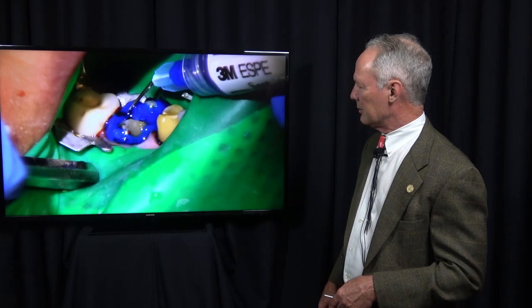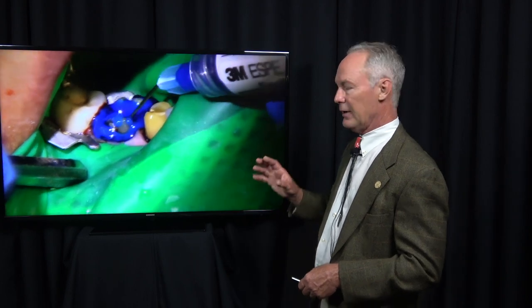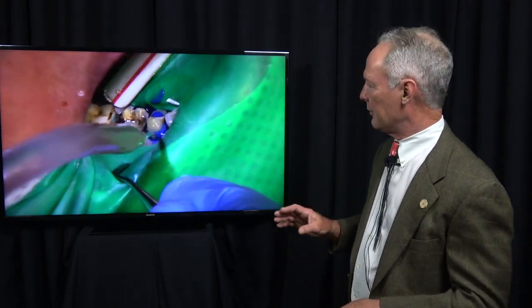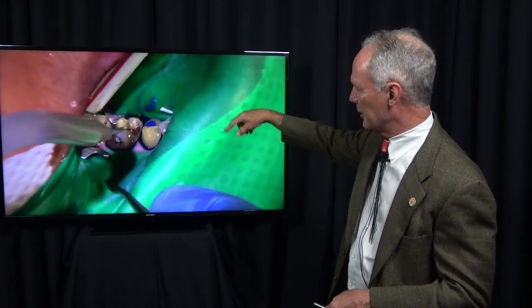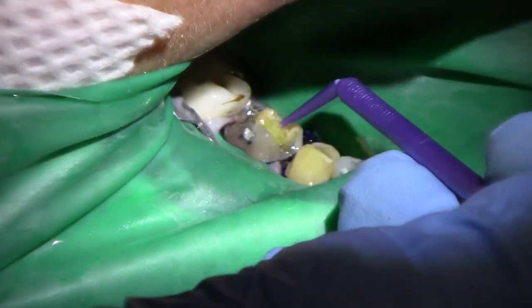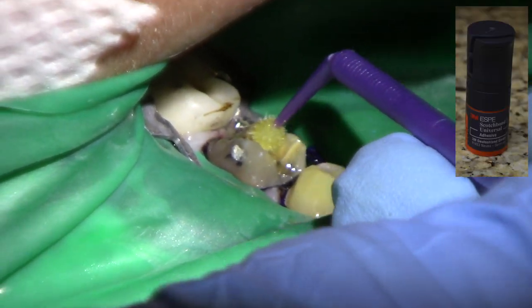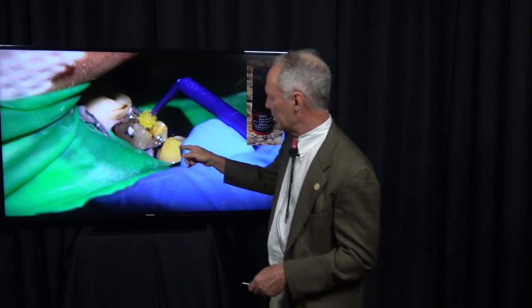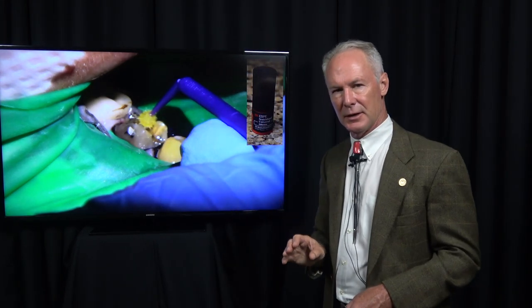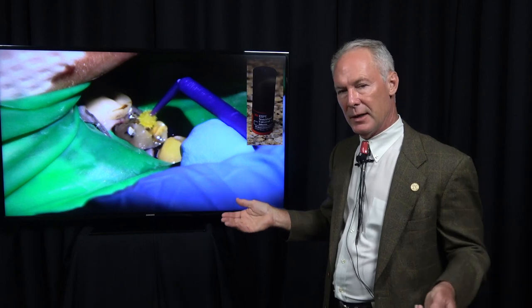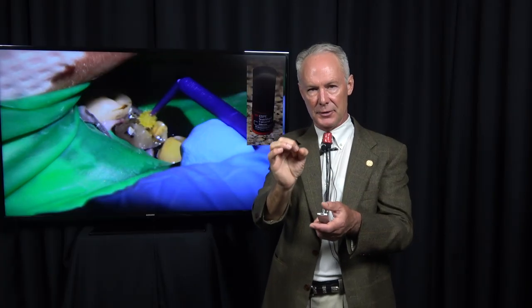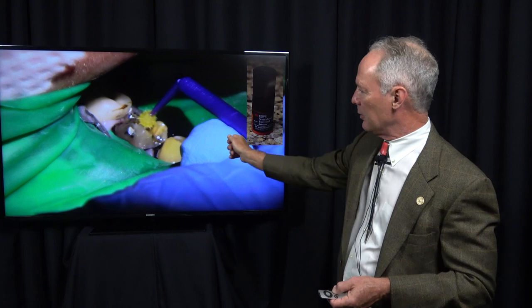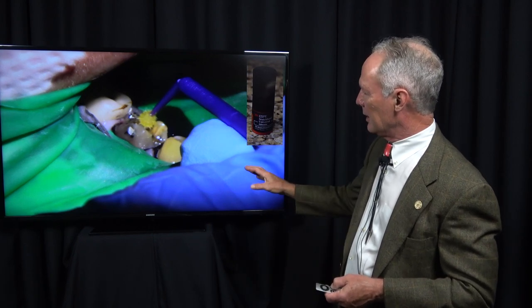Etch. 38% phosphoric acid is very effective hemorrhage control. I found this out by accident. If you leave that on those areas for about 30 seconds, it will cause the bleeding areas to scab over. I'm also etching the inner part of these teeth, 15 seconds on dentin, 30 seconds to a minute on enamel. Rinse that off with ice cold water and then leave it wet.